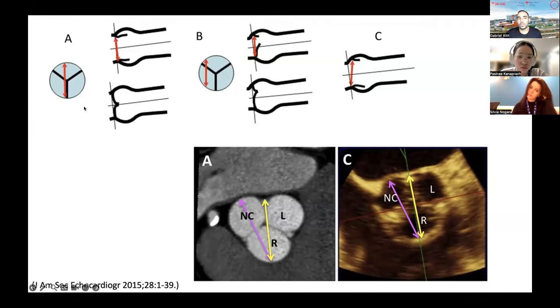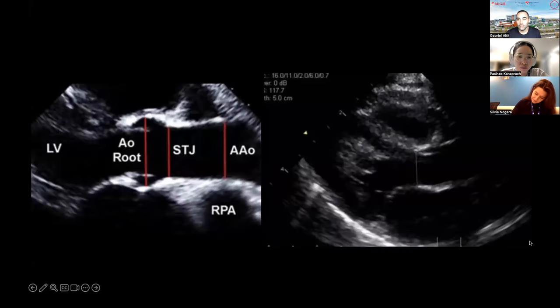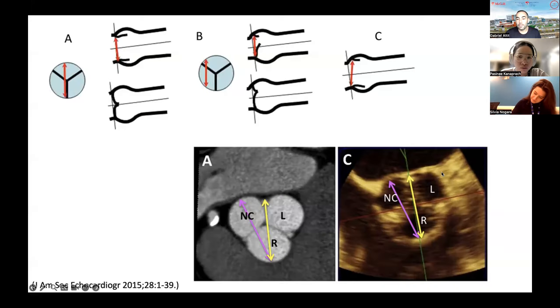So when we're assuming it's a circle, we're aware that there is a geometrical assumption that's not completely true, because we typically will use the diameter that we measured here, and we'll use this diameter to calculate a surface area. So the cross-sectional area of the left ventricular outflow tract. That's what we're going to be using to calculate the left ventricular output. And you can see that depending on where you're doing your 2D cut, the image you're going to get is going to be very different, right?